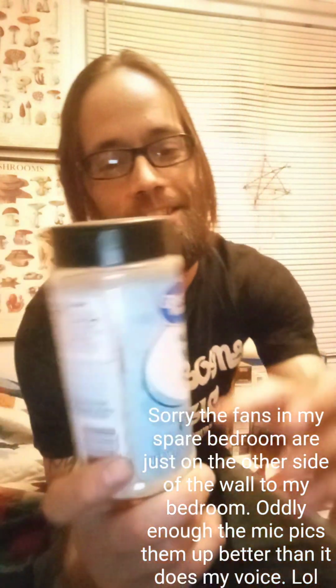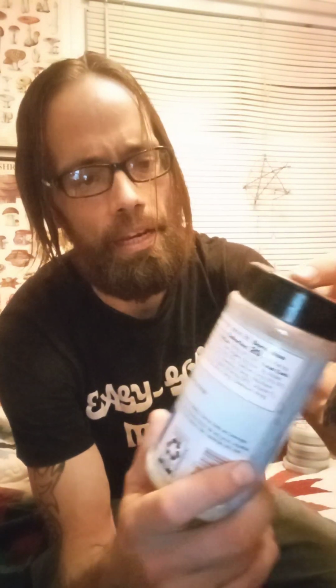Here's another nutrition source: nutritional yeast flakes. And sorry if you guys hear the fan kicking on. I can't help that. I'll clean up the audio. But anyways, these are fantastic as an additive. I wouldn't ever do the base of my media recipe with these, but these nutritional yeast flakes provide protein, B vitamins, sodium, calories, carbohydrates. They provide potassium, which is another thing that's important.